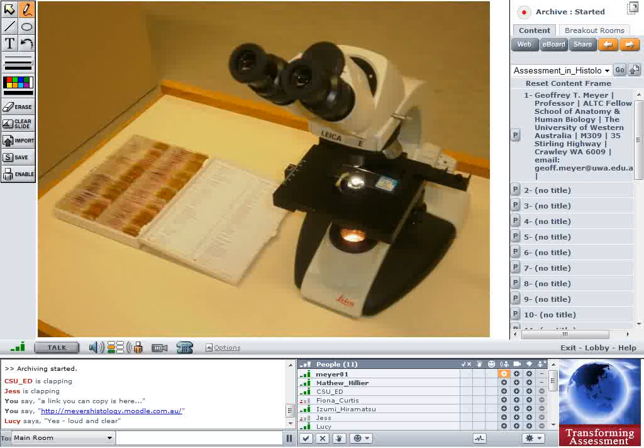Traditionally, for an exam, you would set up a microscope with a slide on the stage. From an exam collection you may have, there may be 40 slides set up. You'd have 40 students come in. They'd spend a minute or 2 minutes at each station and go from one station to the next and identify what tissue or organ is under the microscope, because they need to know that if they're going to do pathology.